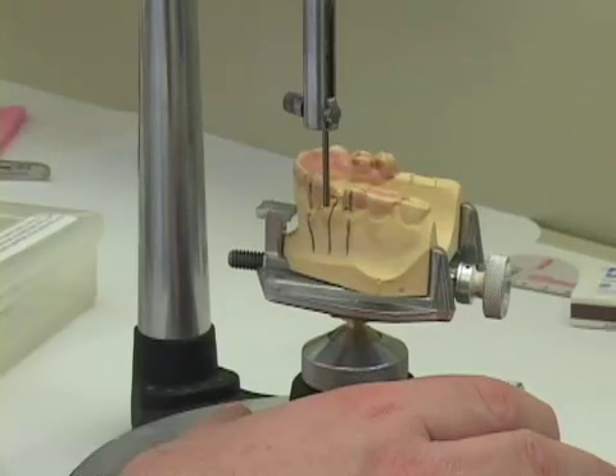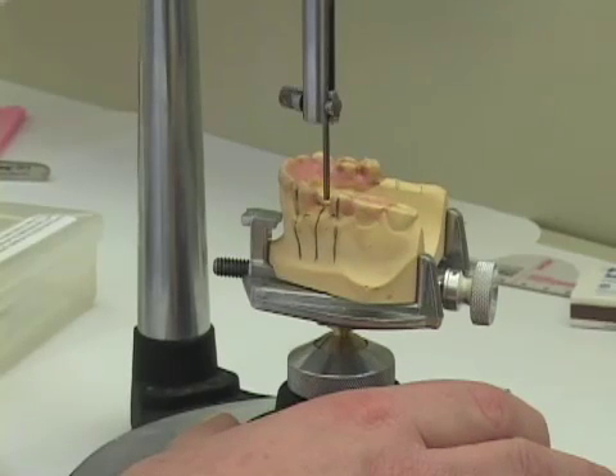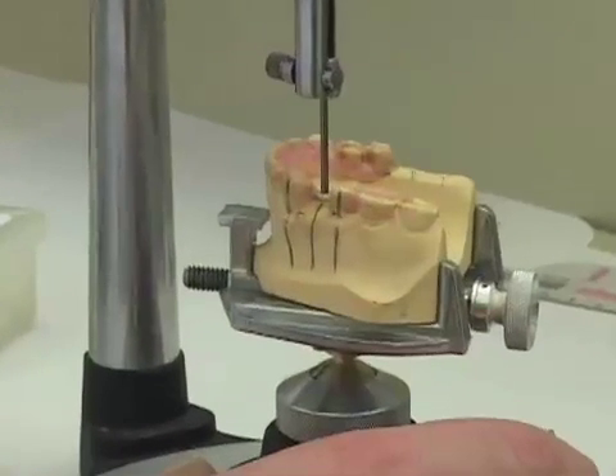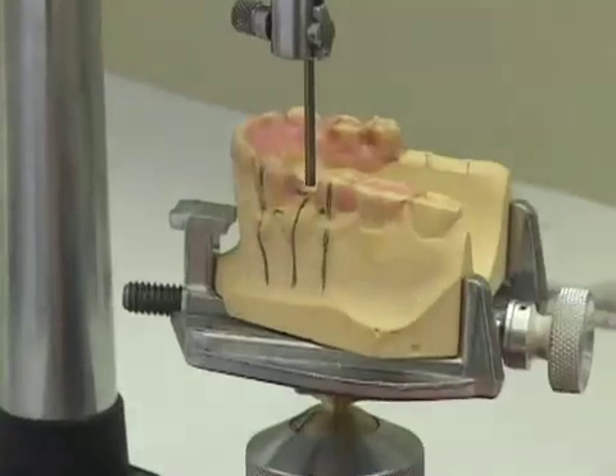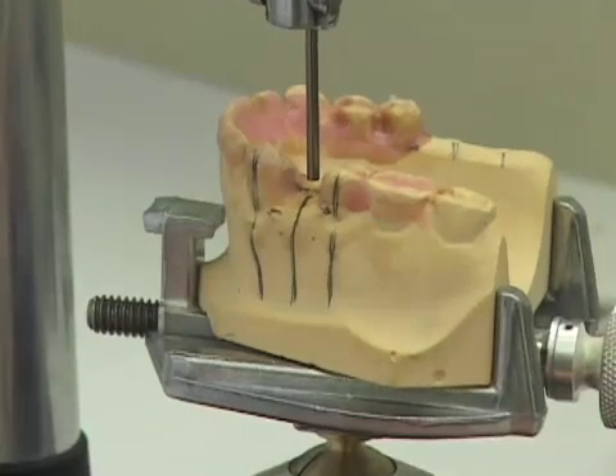We have now verified the angulation and orientation of our implant placement utilizing our radiographic guide, and we will now proceed to make the surgical guides themselves.